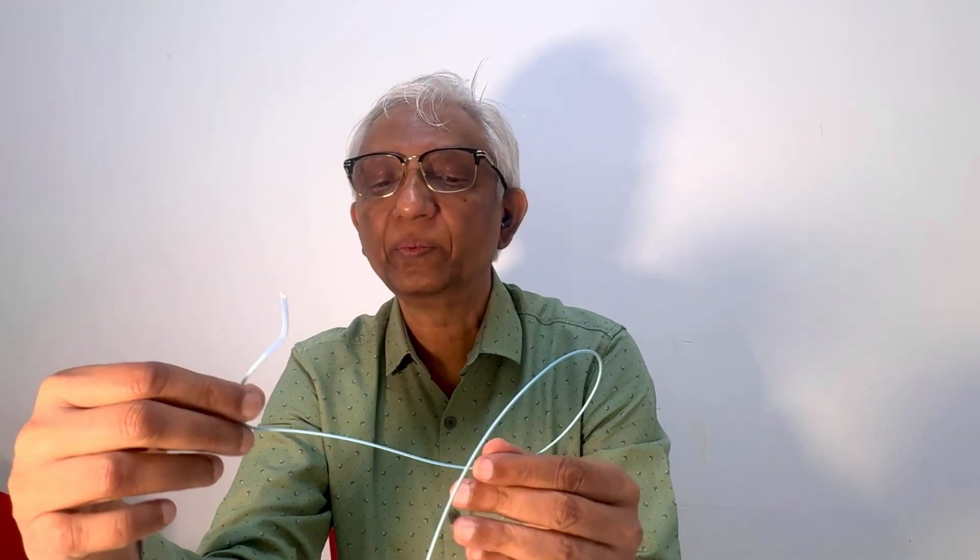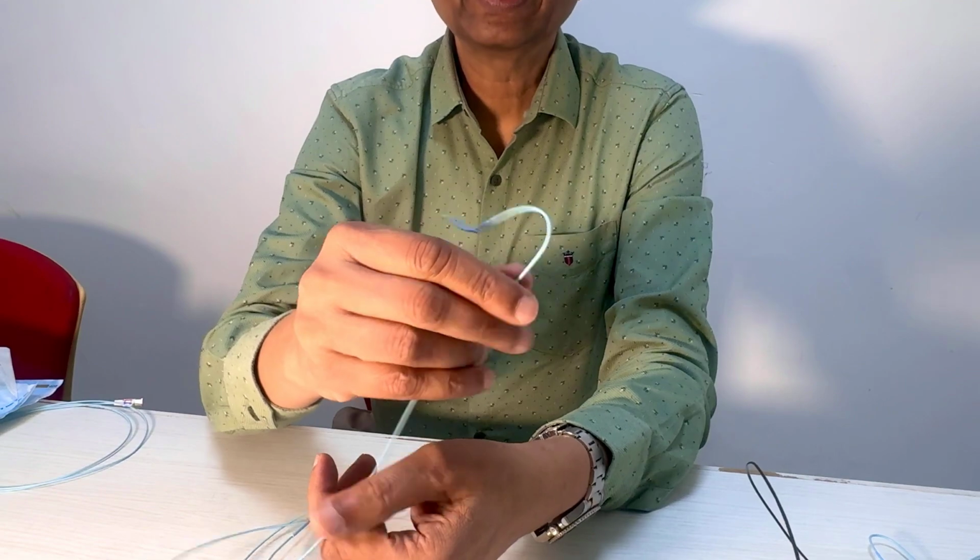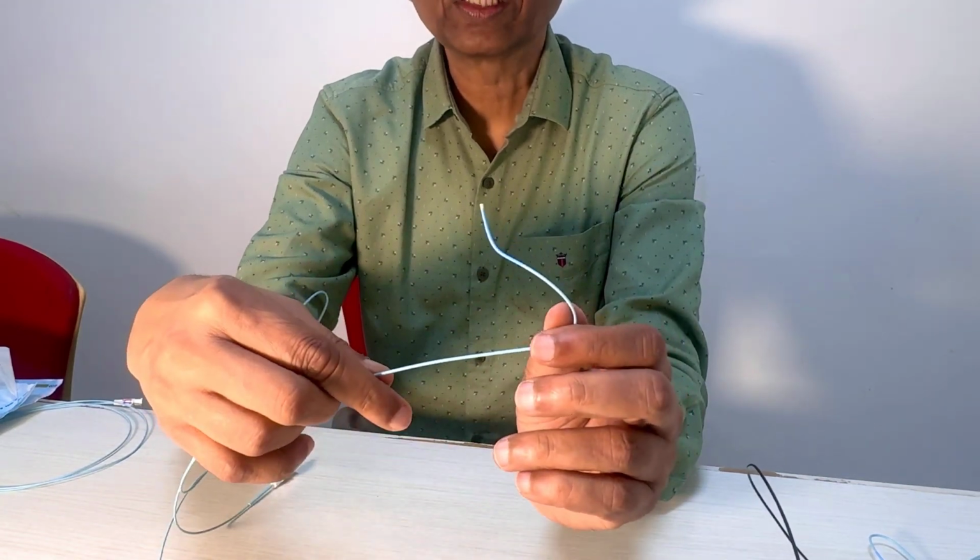But if you want to do a transradial cerebral angio, again, this is the catheter used. Which catheter? The SIM2. The SIM2 allows you to come transradially. You go into the ascending aorta, you make the curve, you come from the arm, and you enter each vessel individually. Remember, the choice of catheter for transradial cerebral angiography is SIM2, not SIM1. And just to make you understand this, this is SIM2 and not SIM1.